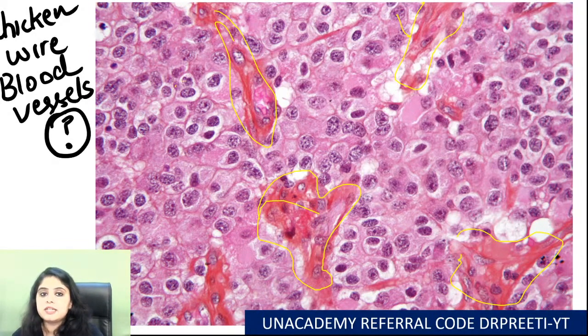And I'll give you a hint. I have a tumor cell and it has white area around it. I have a tumor cell, it has white area around it. It's a brain tumor. Excellent. I've already got my answer from 7 students. Amazing.